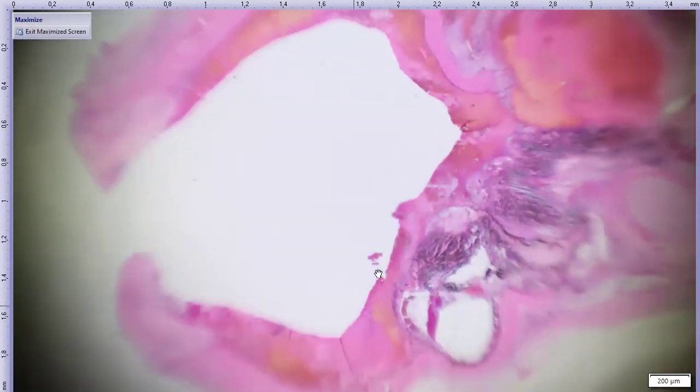But anyway, so here's the globe. The cornea is on the left. And as you can see, it's discontinuous, and that's actually a sectioning artifact. And then when we move back, the inside of the globe has a lot of pink, bright red, slightly orange material in it. And this cavitation that is here is actually also an artifact when it was processed and paraffinized that often can sort of shrink. Some tissues can shrink away from the surface of the block so that when they cut through it, they're actually not sectioning all the way through the tissue.